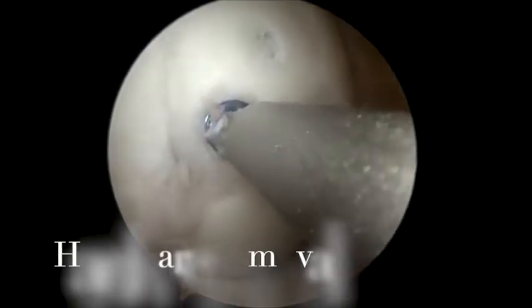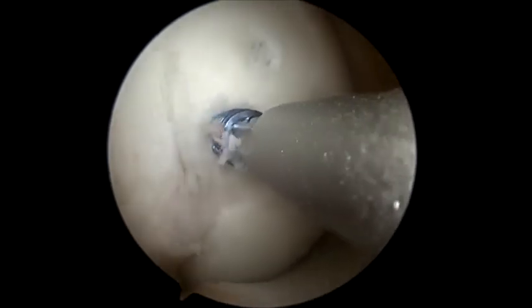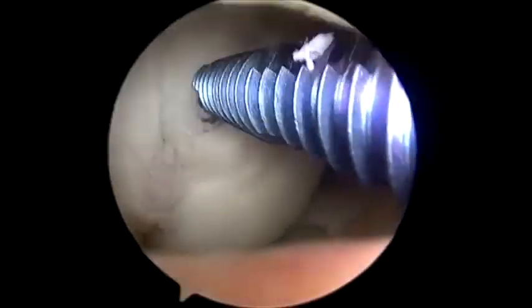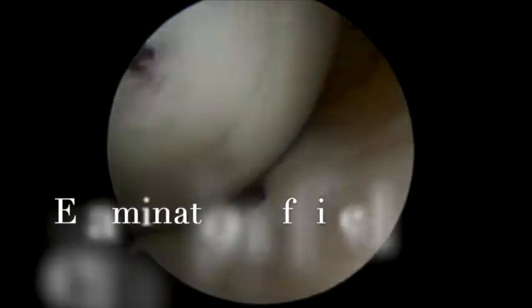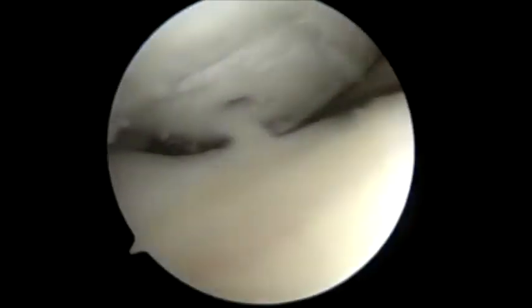At the follow-up procedure, the previously fixed condyle lesion was evaluated and probed to check if it was stable. A small K-wire was used to find the center of each of the headless screws, and then a screwdriver was utilized to remove each of the screws. Finally, the stability of the lesion was evaluated through full range of motion of the knee.